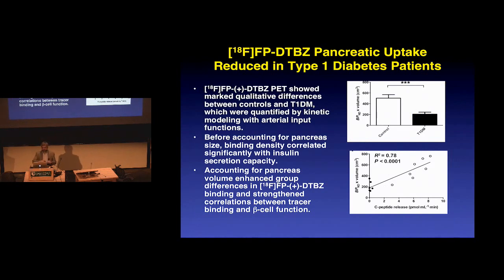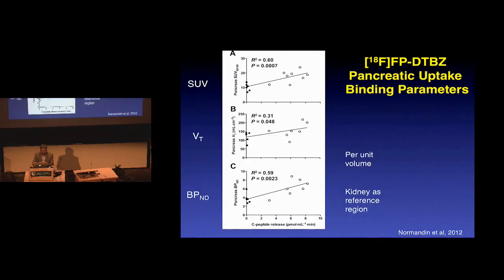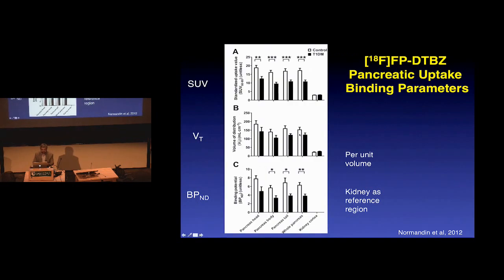We said, you see, we can use this to image the beta cells. Now, it's far from perfect. This, again, is type 1 diabetes. There should be none of this at all. And we reduced things. We reduced the total binding, but not dramatically. In fact, if you go back, you'll notice that the reduction in the binding we have is very similar to what we saw in the streptozotocin rats, that we dropped by about a third. Okay, so there's still some non-specific, as well as probably some specific elsewhere.